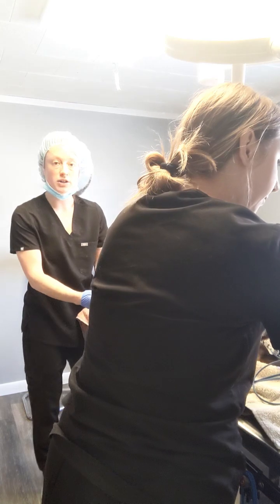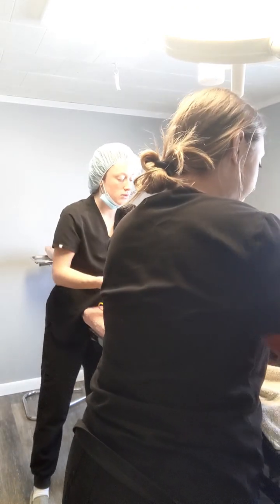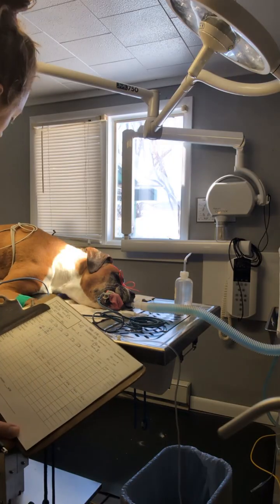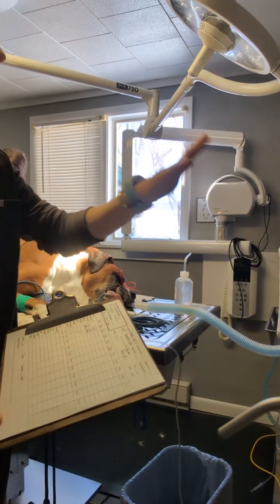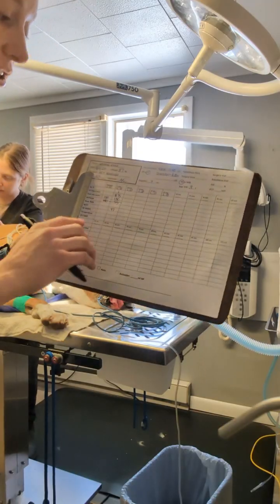So when transferring her to the surgery table, we want to make sure that we're not touching her and that we're keeping everything very sterile. Okay, so while we have our patient, we've got our pulse oximeter showing all of our readings. So that, along with our fluid line and our anesthesia machine, is how I'm gonna monitor during his surgery.